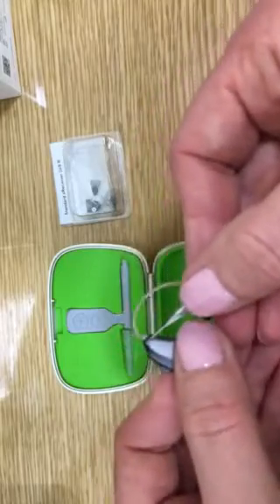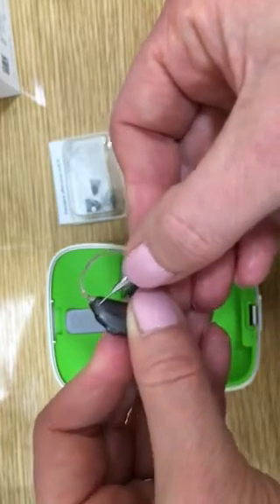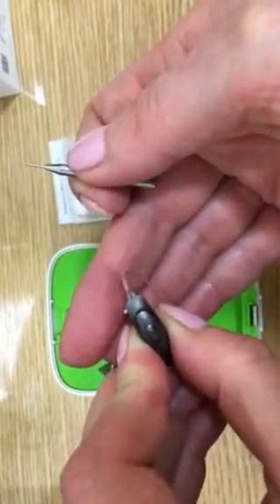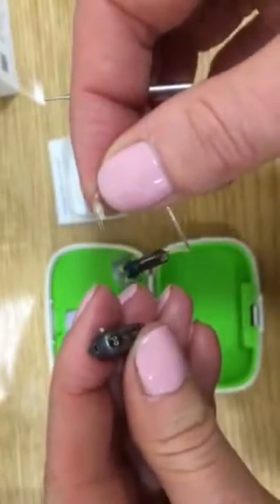We insert the pin removal tool into this aperture, click, and we will see the pin pop out the other side. This will unlock the receiver.